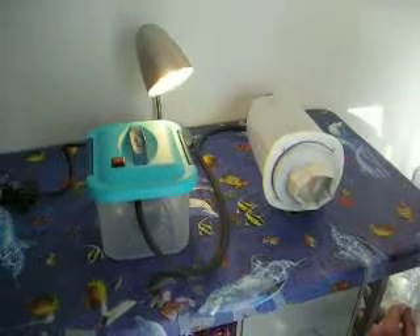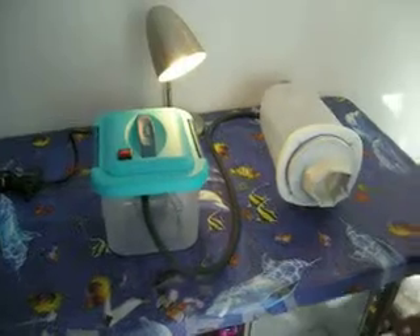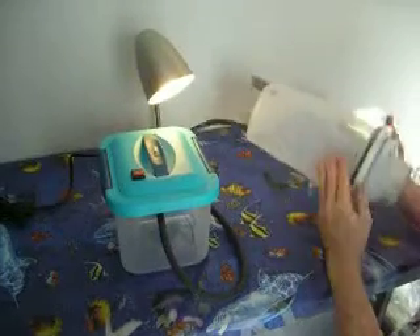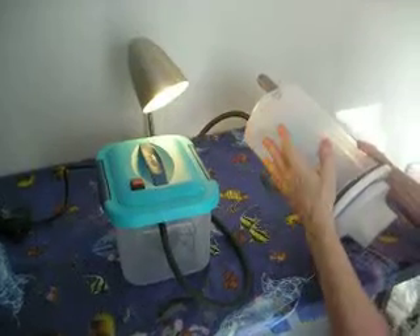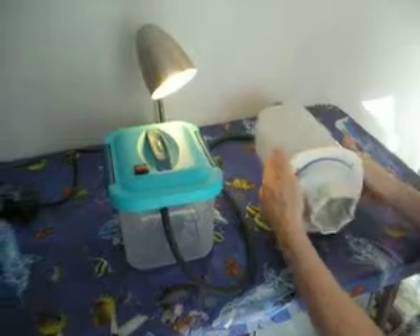This is Bert Schulman from Innovations Unlimited demonstrating VeinVac. VeinVac is comprised of two components: a vacuum pump and a vacuum chamber that has an entry orifice and a vacuum relief valve that maintains one PSI below atmospheric pressure in the chamber.